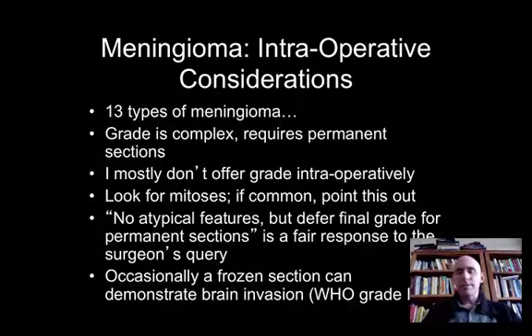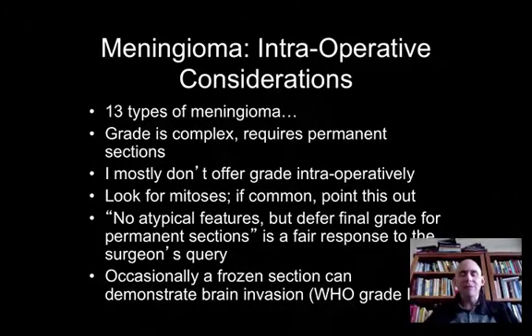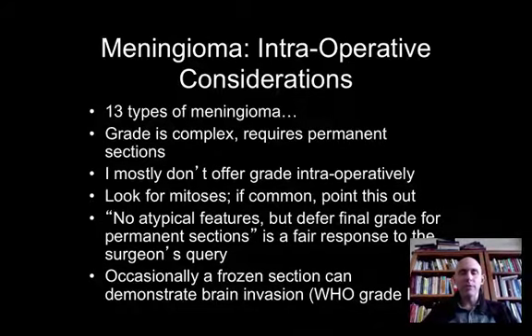So comfortably give the diagnosis of meningioma. If asked about the presence or absence of atypia, be honest, tell them yes or no, that you think there are too many nucleoli, but grading is really not to be performed intraoperatively.